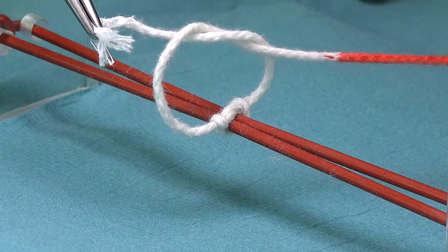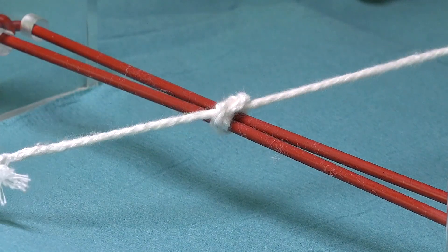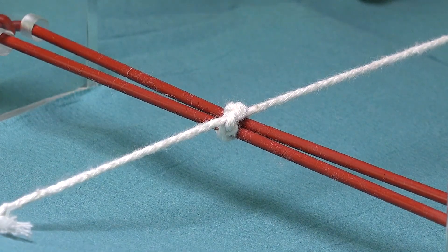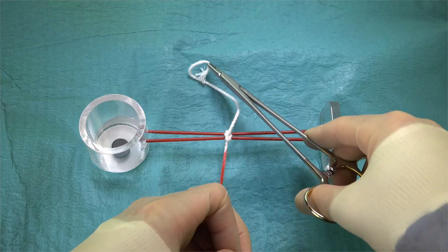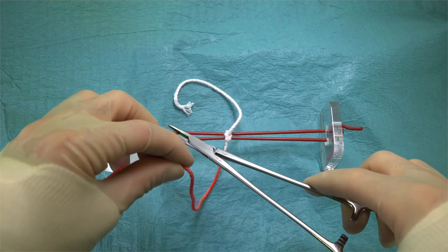We pick up the suture end line closest to us with the instrument, and pull it through the loop, taking it away from us at 180 degrees. This forms the second throw of our instrument surgeon's knot.